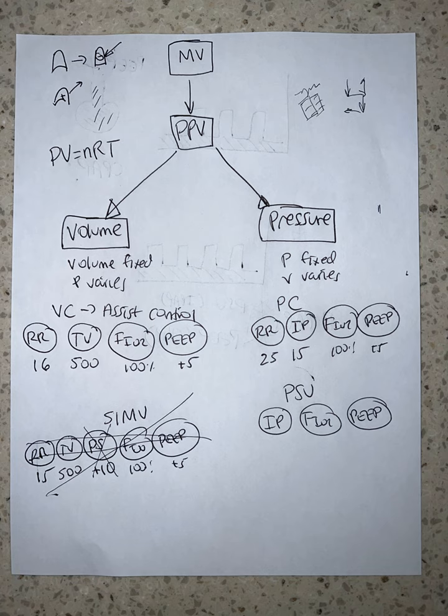What makes mechanical ventilation intimidating or difficult is that there are so many different manufacturers, and they all have proprietary names for the same thing. There's all this PV this and NR that, and it makes it complicated when it really is not complicated. So let's focus now on volume ventilation.